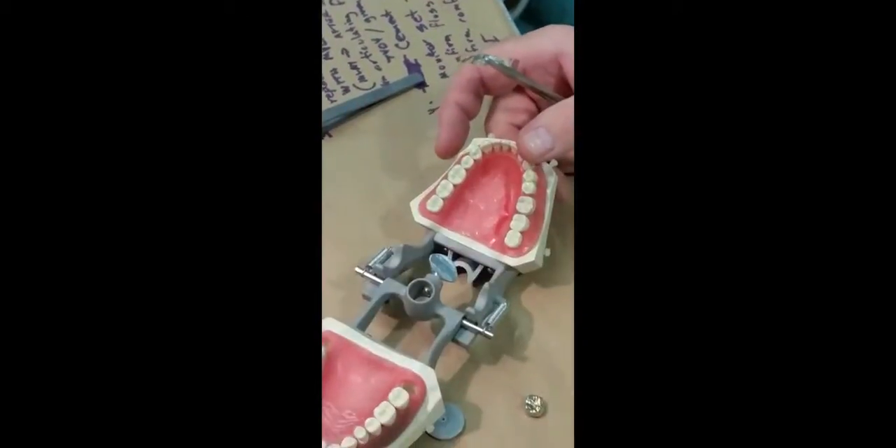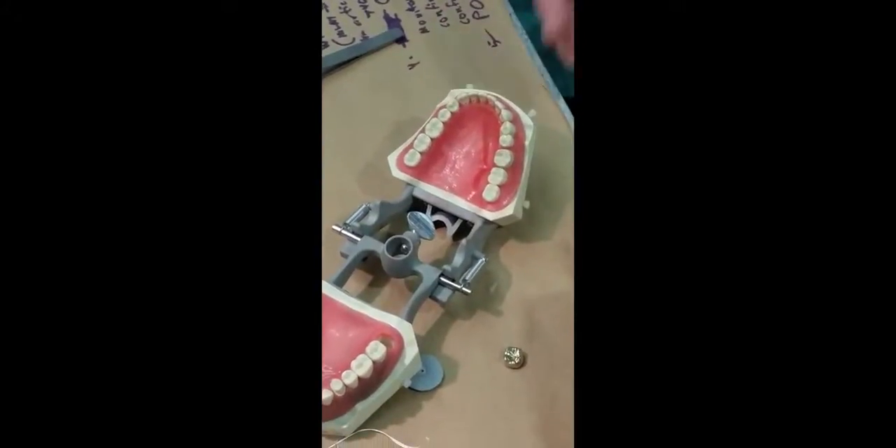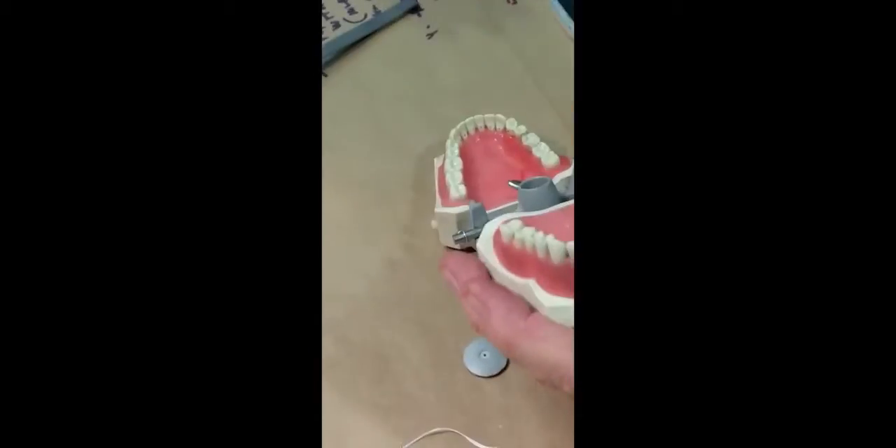What you want to use is arty foil — red arty foil — for adjusting your crowns. It's not available in clinic, so you'll have to supply it yourself. They will give you articulating paper in clinic, but it's all too thick, so bring your own.